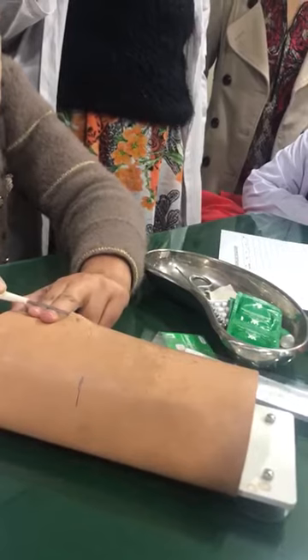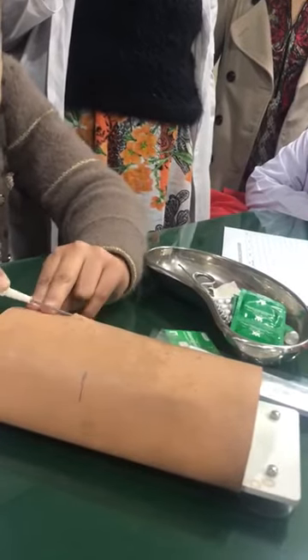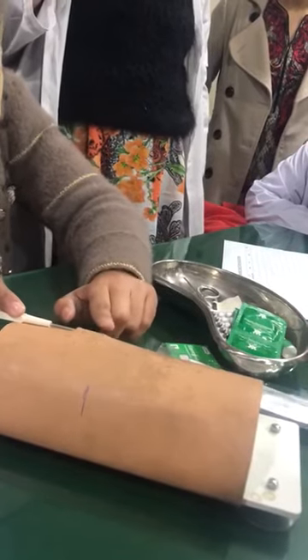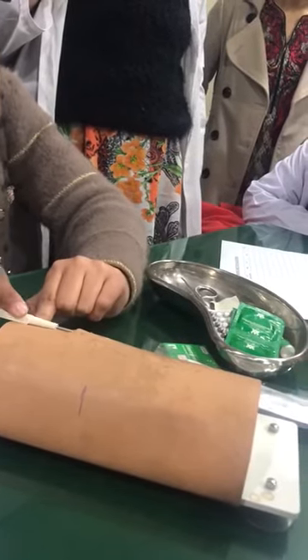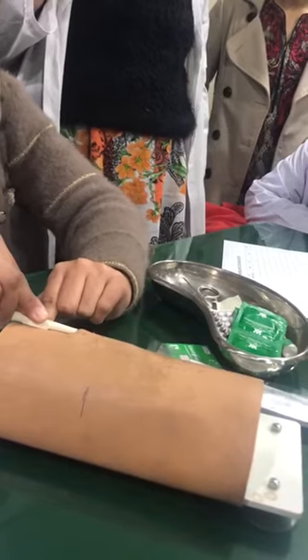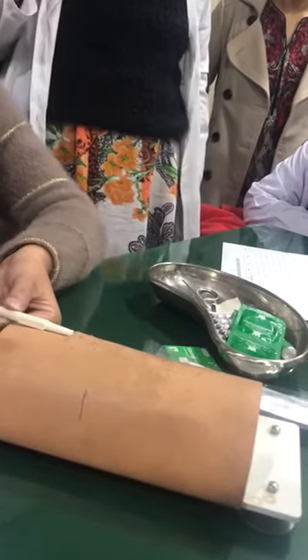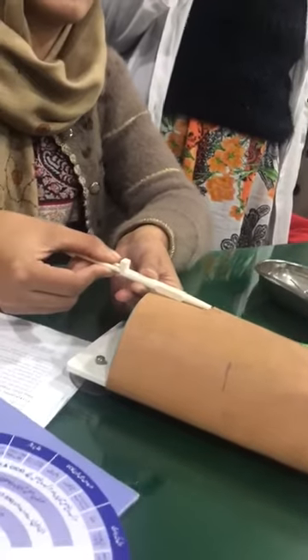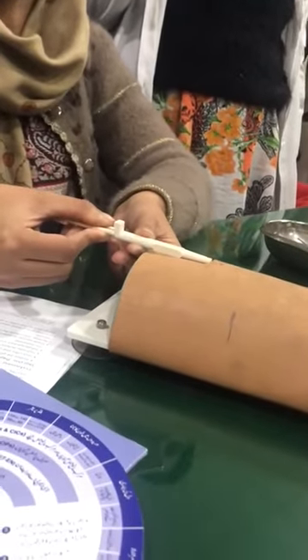Now take a straight path under the skin in the correct direction. All the dermal plane are set up. Now rotate the device 90 degrees. Break and rotate 90 degrees to deploy the capsule.